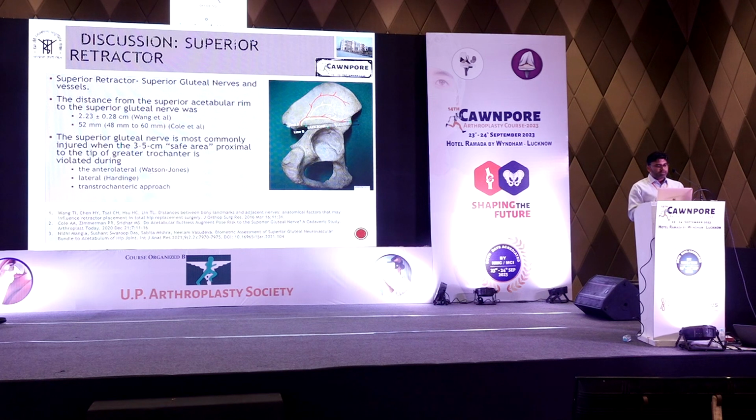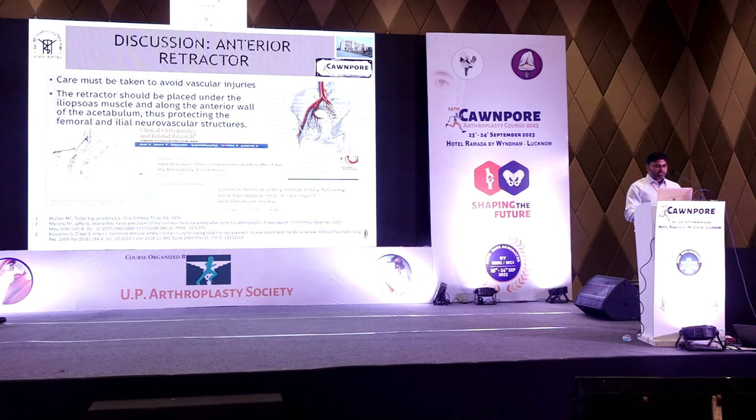So, but the nerve palsies have been seen more often in the anterolateral or the Watson-Jones, the Harding and the trans-trochanteric approach, and not the posterior approaches. Now coming to the anterior retractor, this is one thing which people are often much scared about. So the technique that I showed, lifting off the femur by the bone hook and exposing the whole of the anterior capsule, is the crux, so that you can release the capsule from the acetabular side and not midway.